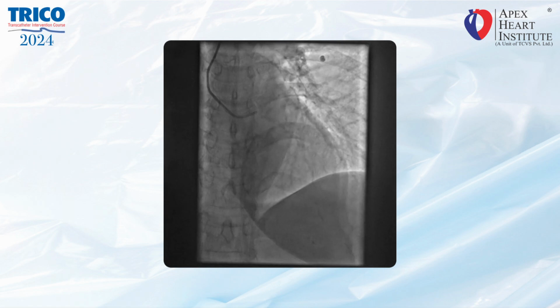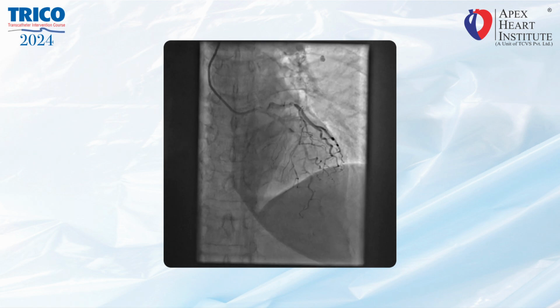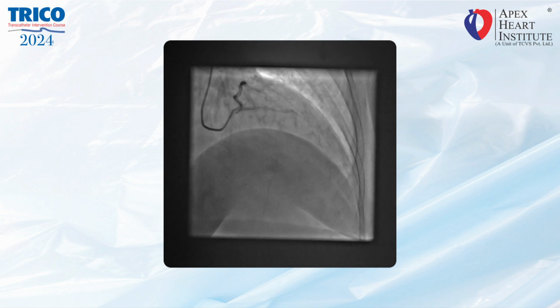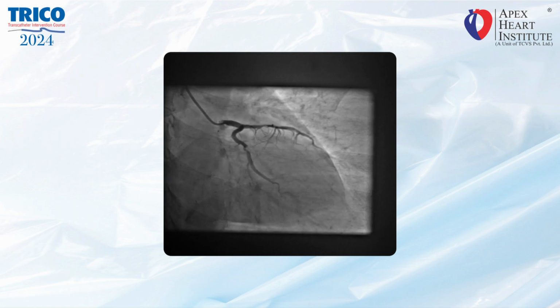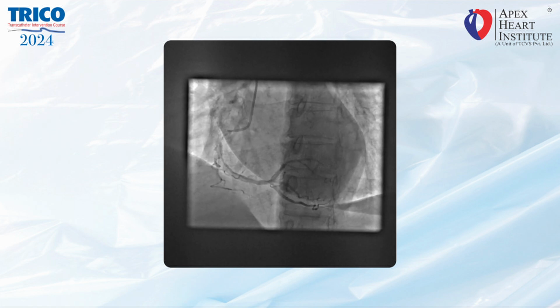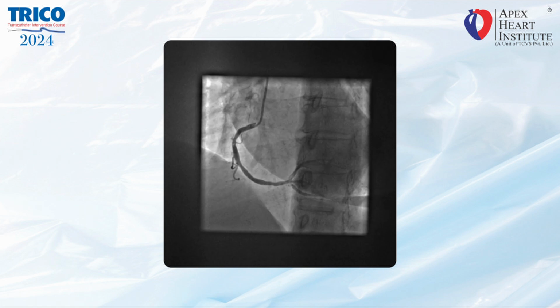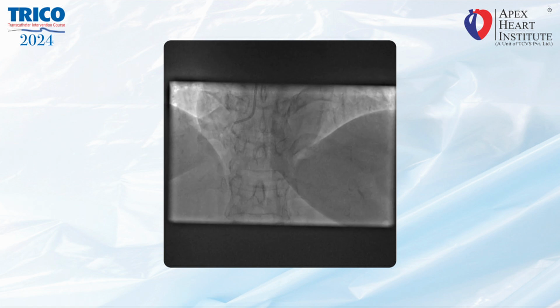These are the left views. The lesions are discrete but extremely heavily calcified. You can go to the next, please. Rajiv and Khaled and all other panelists, are you able to see the calcium there? Yeah, these are beautiful images, Tejas. We can see them well and we can hear you well. Focal, heavily calcified lesions, and this is the right, which probably has the maximum calcium load, and it has two lesions, one at the bifurcation also, and I will be embarking upon the right first.